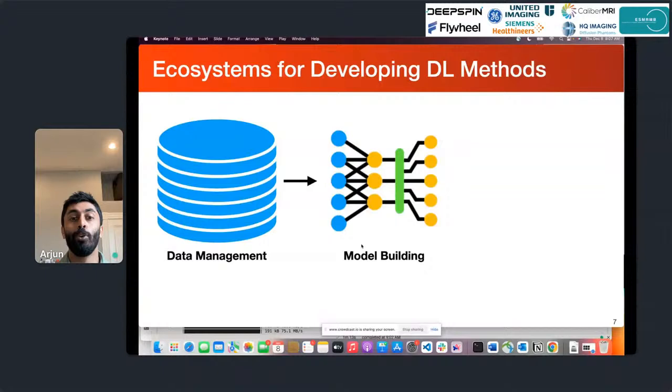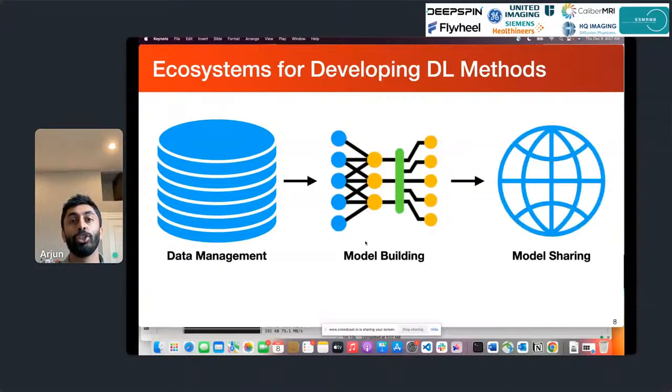And I think one lofty goal in the spirit of MRI Together is really we want to be able to share the models and the methods that we build quite ubiquitously. So this is not just with our collaborators, but hopefully at some point with the broader community and even beyond. And we need to make sure that this process is very simplified because we don't want to spend too much time in actually sharing the model because that should not be the bottleneck for sharing.